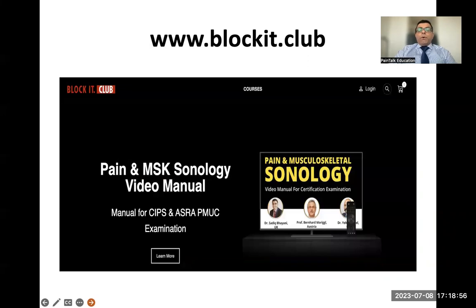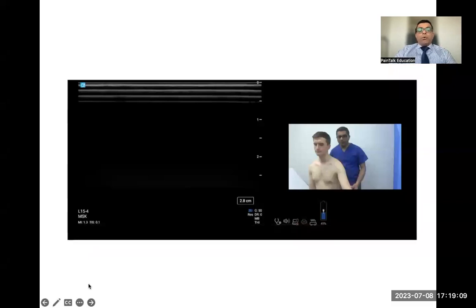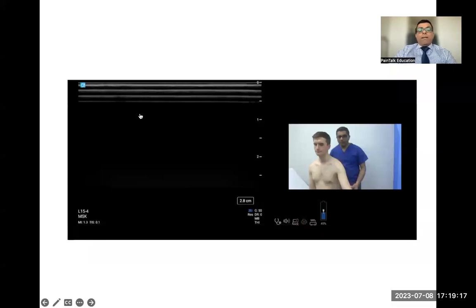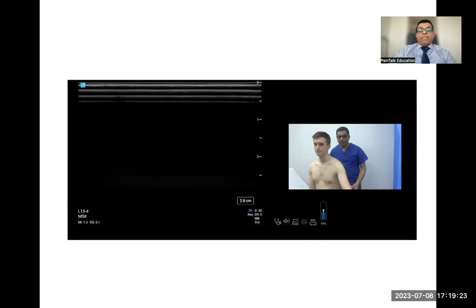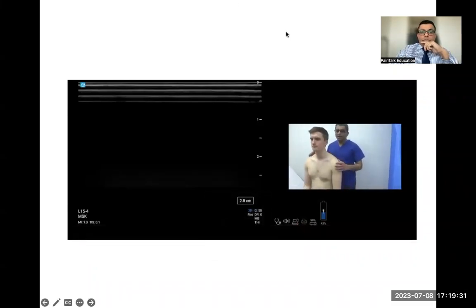I'm going to show you a few videos from the Pain and MSK Sonology video manual at BlockIt.Club. This is the acromioclavicular joint injection demo video. The stepwise approach is very important: position, arm, and scan. The patient sits in a neutral position with the arm supine — this is used for the majority of ultrasound-guided procedures.